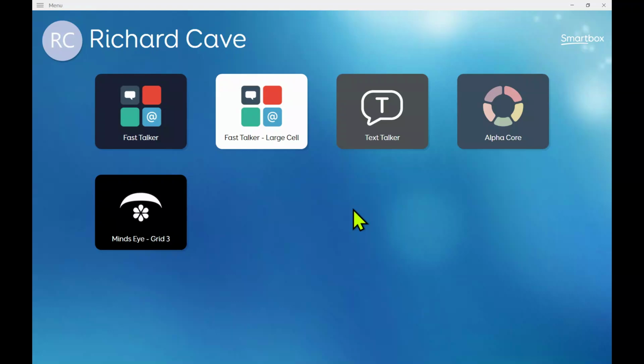And of course, we'll talk about this in the session, but you can save stored messages using 11 Labs voices in all the AAC that I know of, and therefore you don't have to be online all the time to use 11 Labs voices if you store messages offline. But of course, for novel speech, then you do need an internet connection. All right, I'll stop there.